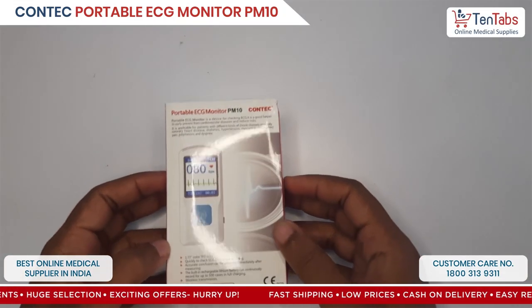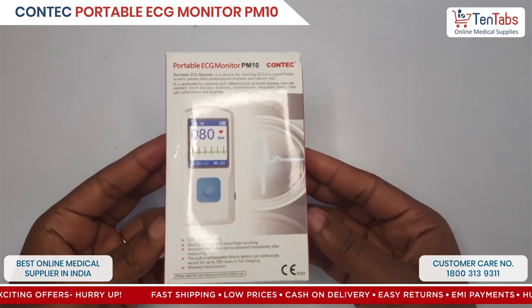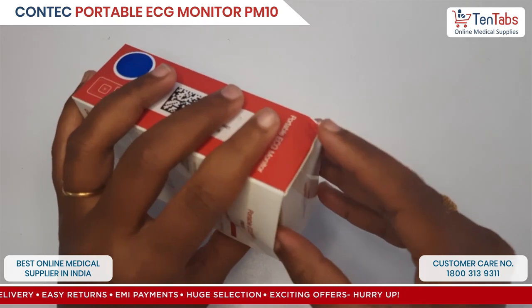Hi all, today we are making an unboxing and installation video for KONTEK PM10. This is a portable ECG machine. So firstly let's see what is in the box.